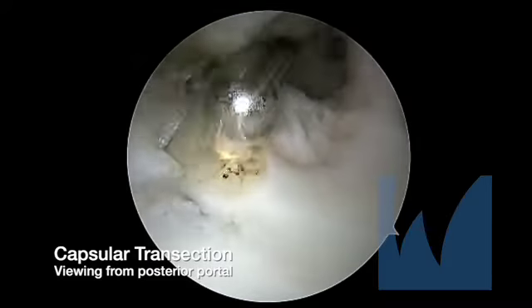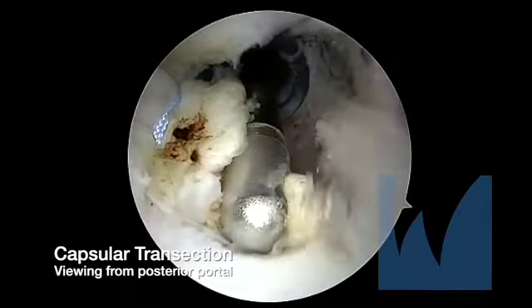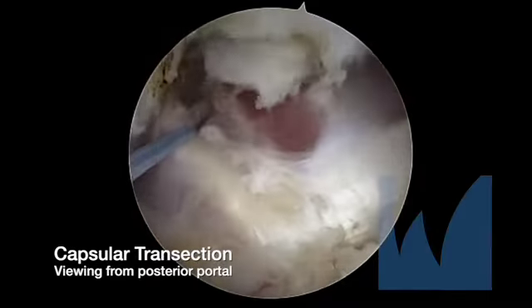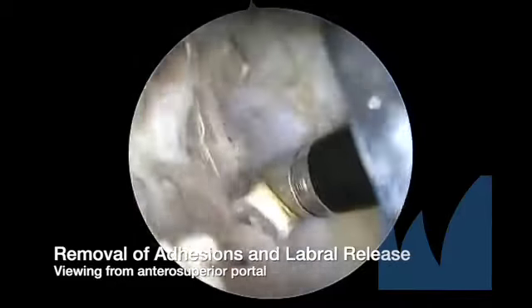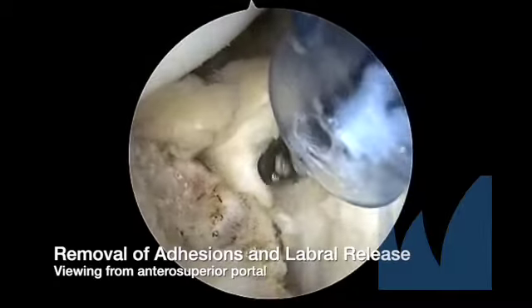The anterosuperior glenohumeral capsule is then transected superior to the traction suture. Transection continues until the coracoacromial ligament and the conjoined tendon are visualized. An ablator is used through the antero-inferior portal to remove adhesions to the coracoid neck and release the labrum from 12 to 6 o'clock.